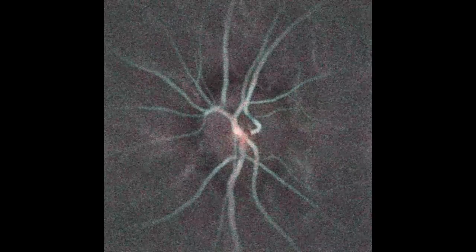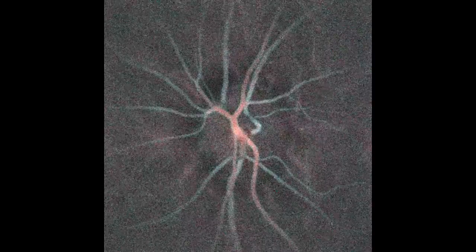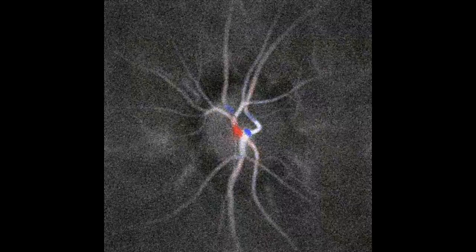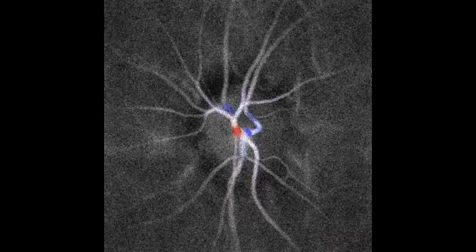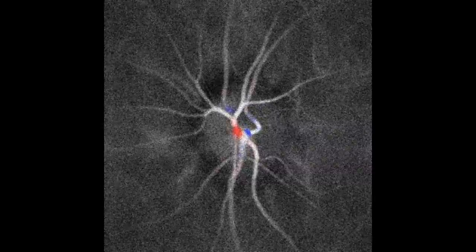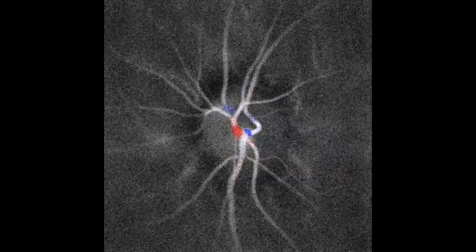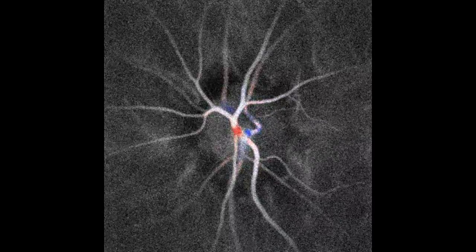second. This composite color version of the same video shows the local Doppler broadening. A diversity of measurements can be computed afterwards from the same interferometric data, such as the asymmetry of the Doppler spectrum here, which reveals blood flow in the lumen of the out-of-plane vessels, namely the central artery and vein.